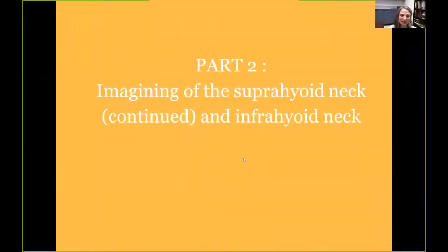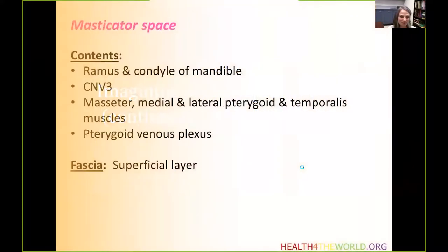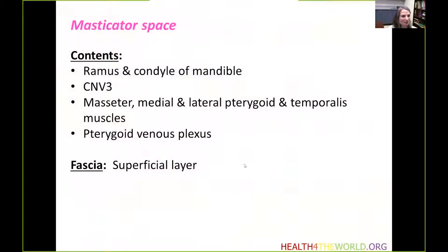Welcome back. We're going to continue our discussion about imaging of the suprahyoid neck and we will also take a look at the imaging of the infrahyoid neck. Continuing with the suprahyoid neck spaces, let's go on and take a look at the masticator space.